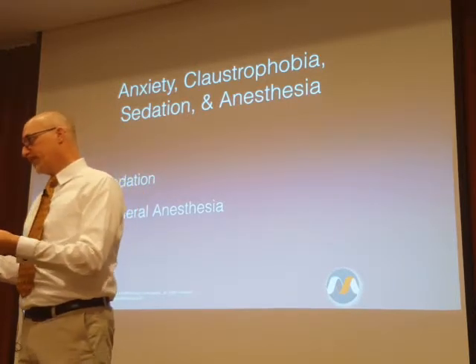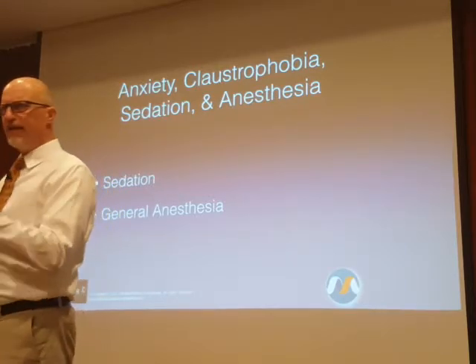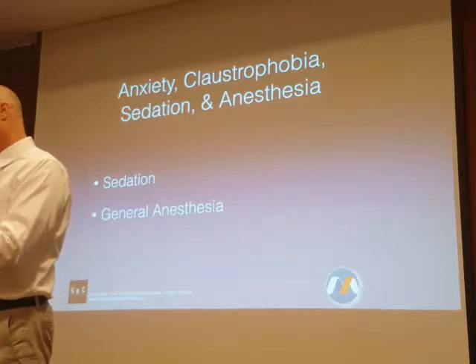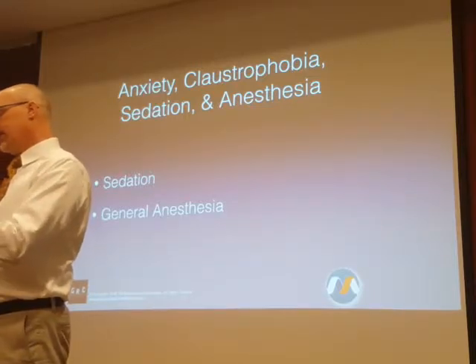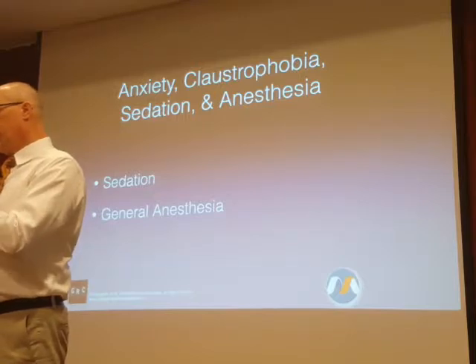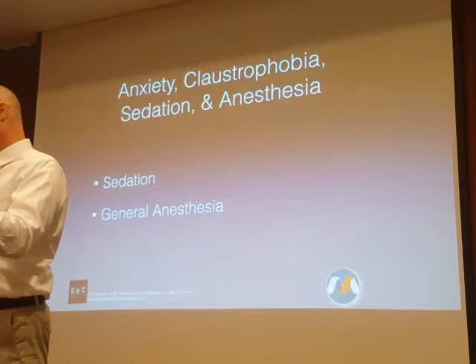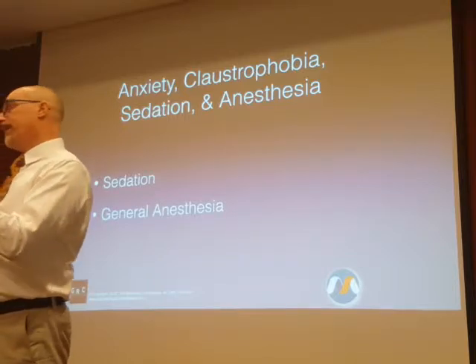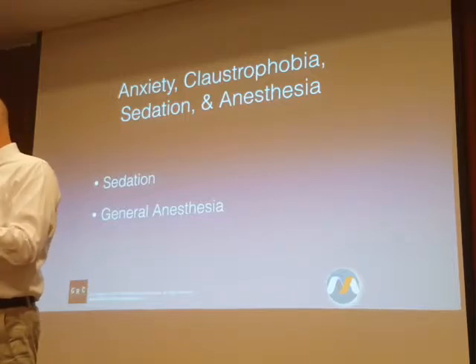If whatever the object is in adipose tissue, is in fat, fat is a tremendous thermal insulator. If it's in adipose tissue, any heat that collects in that object is not going to dissipate very effectively. Let's take my pacemaker lead as an example.